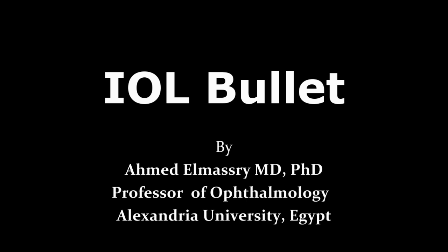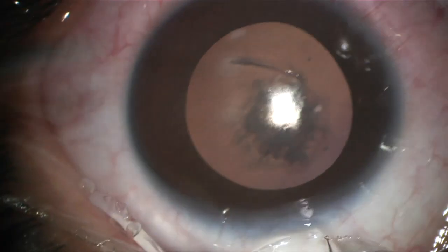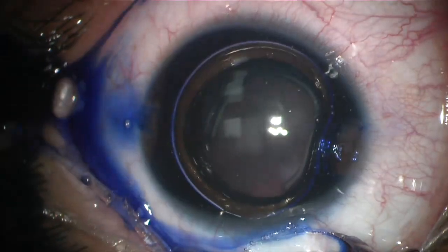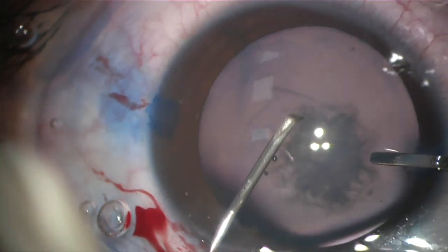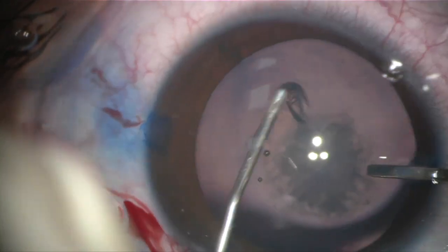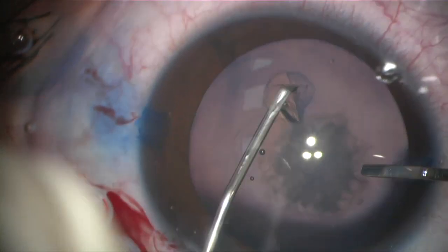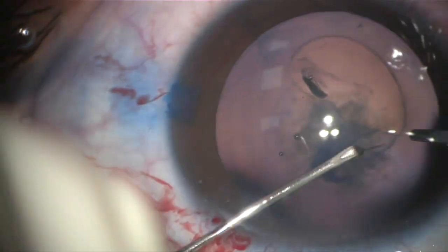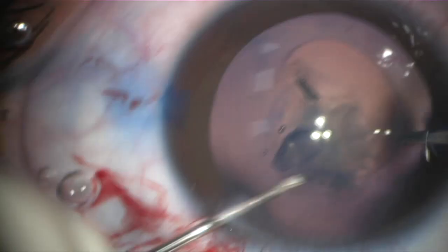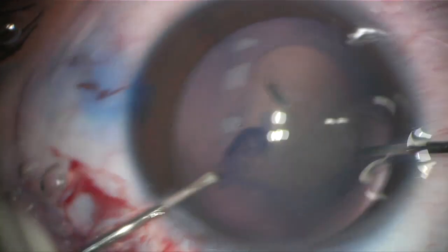This nine-year-old boy has a straightforward posterior subcapsular cataract and is planned for cataract extraction and intraocular lens implantation of a hydrophobic IOL. After capsular staining with trypan blue, the anterior capsule of children is usually very stretchable and elastic.